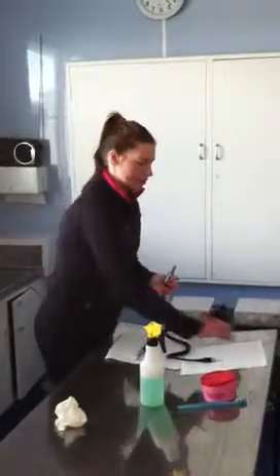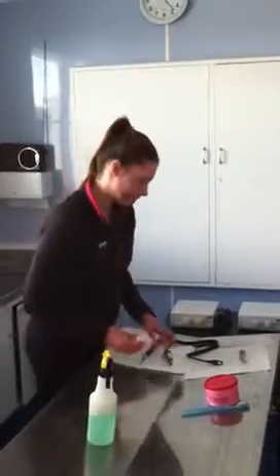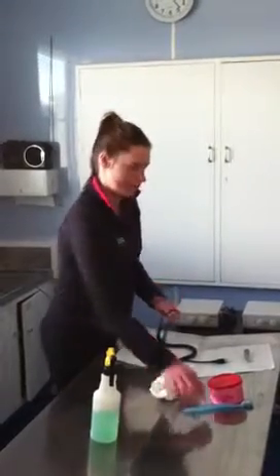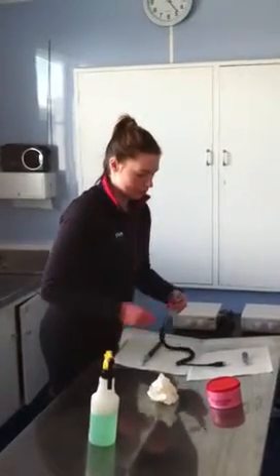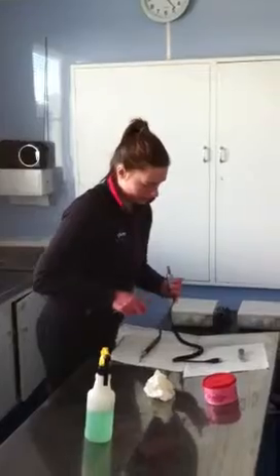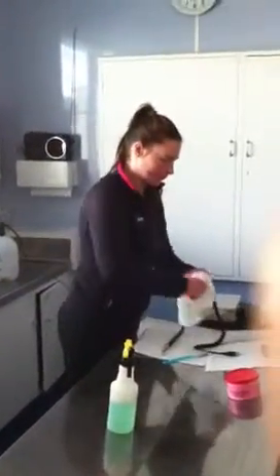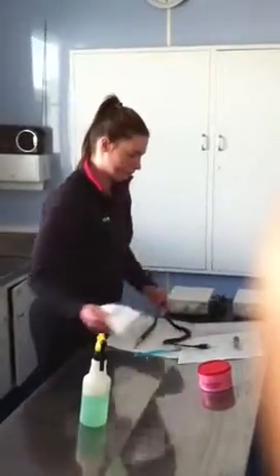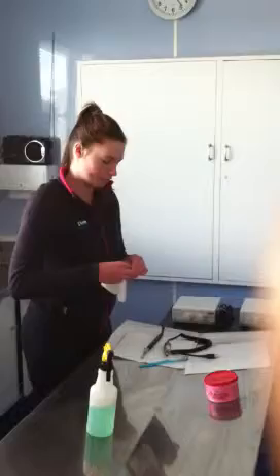I'm just going to take apart the polisher head and wipe around that area. I'm going to take a brush that's designated for the straw and ensure that all the interior is clean from fluid and debris. Then I'll repeat the same steps on the head of the polisher.